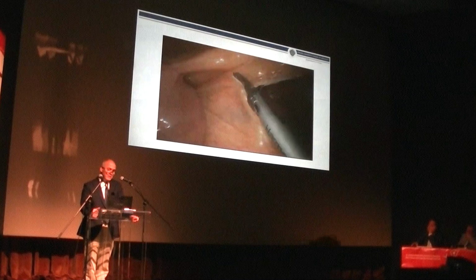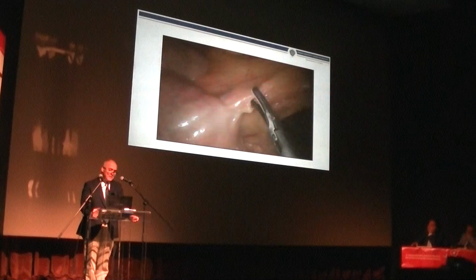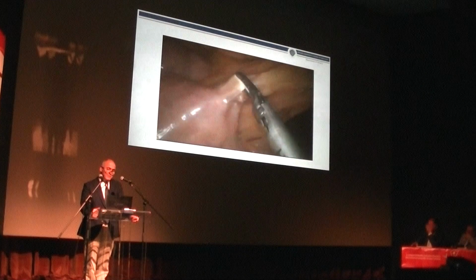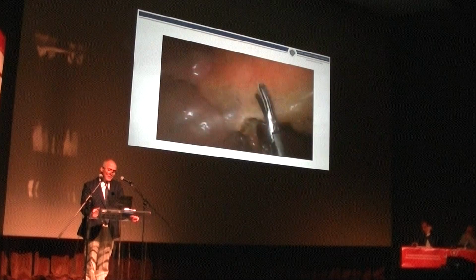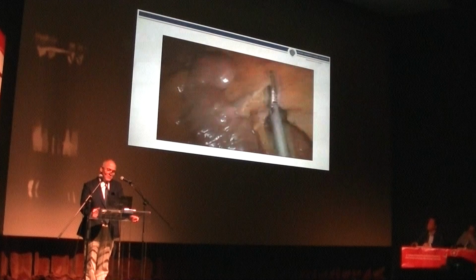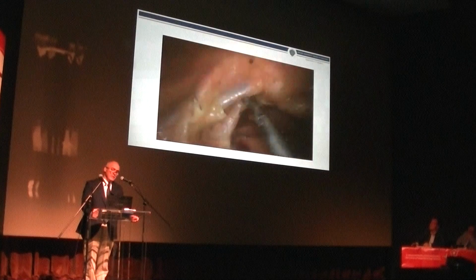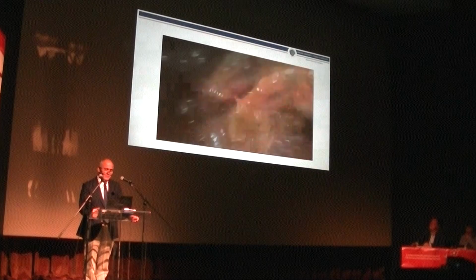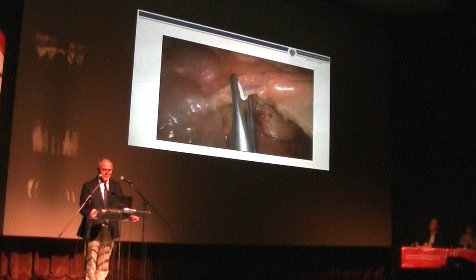Although many know that the inferior mesenteric vein is always there, there might be an artery accompanying the vein, and this may cause problems. And here I realize the artery, so I try not to transect the artery, and try to look at the vein and mobilize the vein. I really am sorry, but I tested this before, and I don't know what happened now.